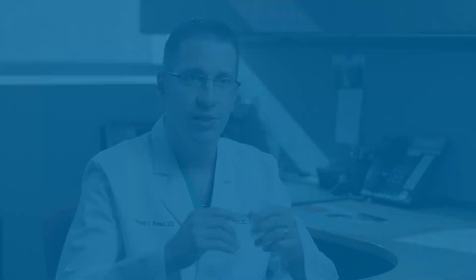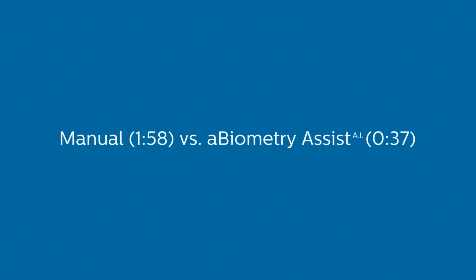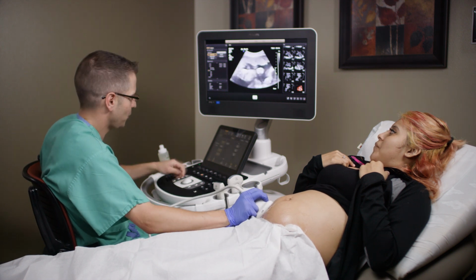We have seen a significant reduction in keystrokes, and we have also seen a reduction in actual time it takes to conduct completion of those measurements. It provides utility, particularly in our practice, because we are a busy maternal fetal medicine practice. We do thousands of ultrasounds a year, and really anything that saves us time on each patient throughout a day helps us to provide better care to patients, because I can actually spend more time with the patient if I'm doing less measuring. I can also actually spend more time seeing additional patients. So all of this adds up to a more efficient office and better care for the patient.